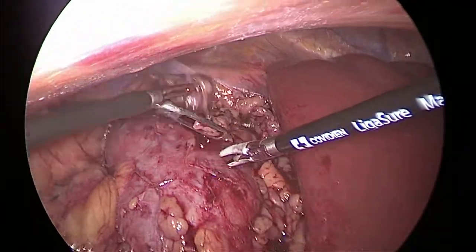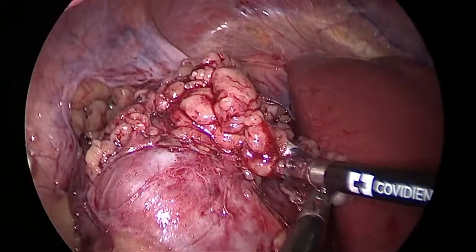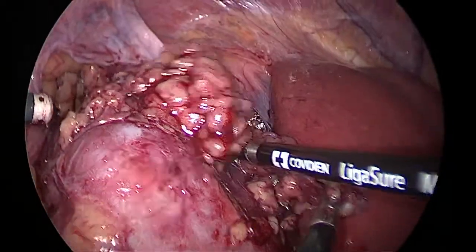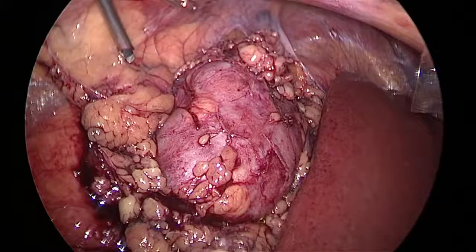You can see the tumor. This is partly exophytic.